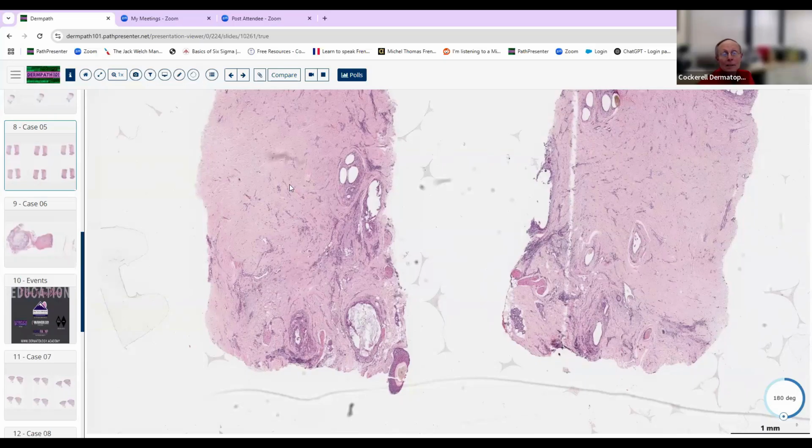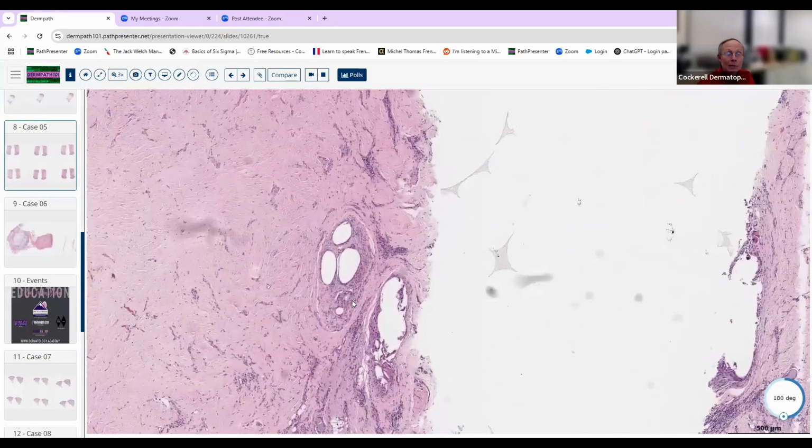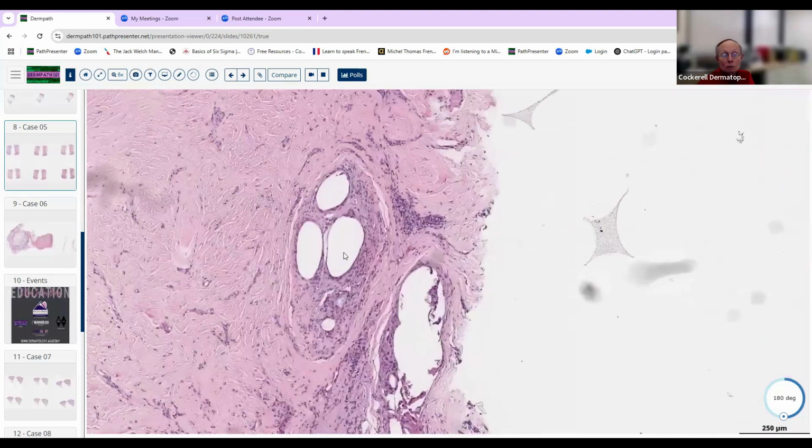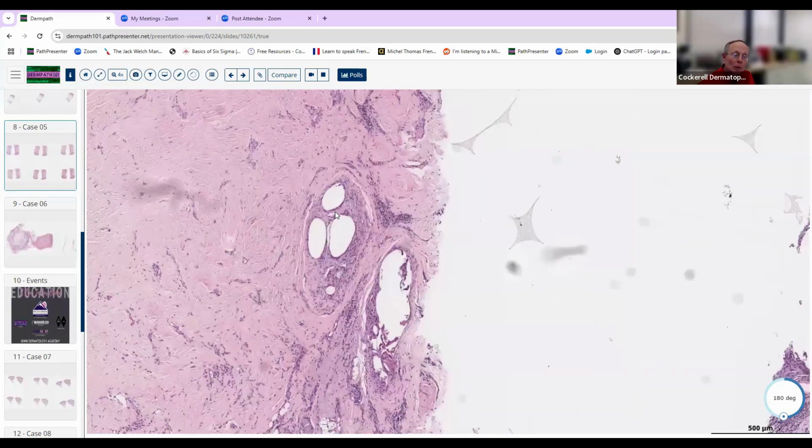Now, when we start looking at the follicles that are remaining, there are some clues here that might give us some ideas about the diagnosis. You've got these three residual ghosts of where hair shafts used to be. So maybe a little bit earlier in the life of this alopecia, you might have seen some tufts with a few little hair shafts coming out of it. That doll's hair-like clinical morphology is pretty characteristic of lichen planopilaris or central centrifugal alopecia, which basically histologically looks the same.